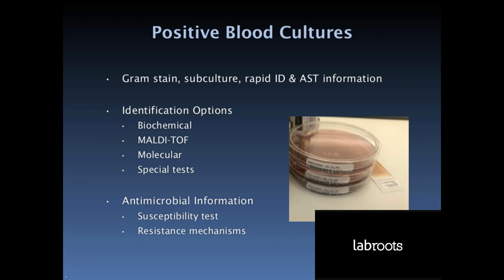If the blood culture is positive, the gram stain must be quickly done and reported. Microscopy can indicate if the pathogen is bacterial or fungal, and possibly what the organism may be. This can give the physician a clue for therapy.